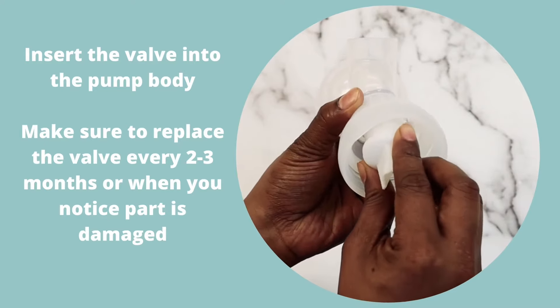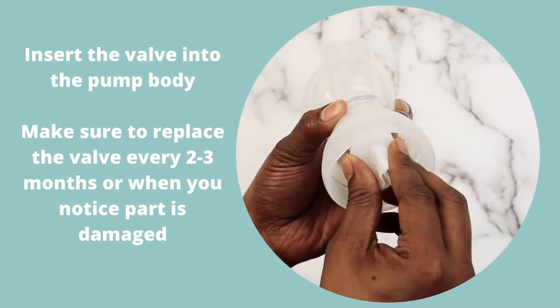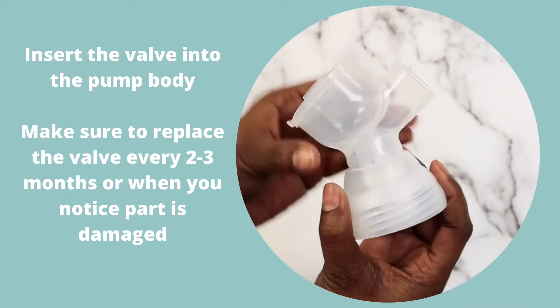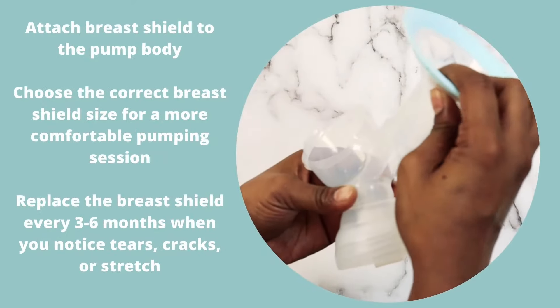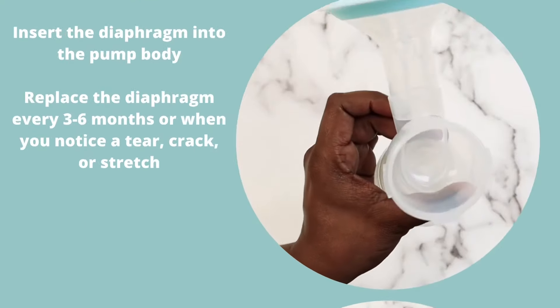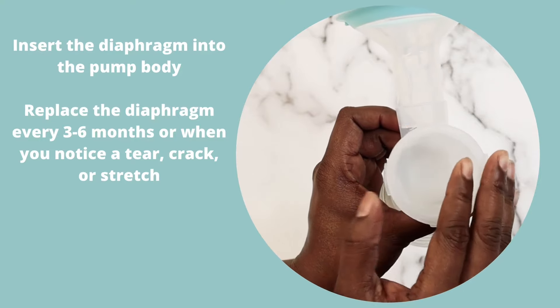Insert the valve into the pump body. Attach the breast shield to the pump body. Insert the diaphragm into the pump body.